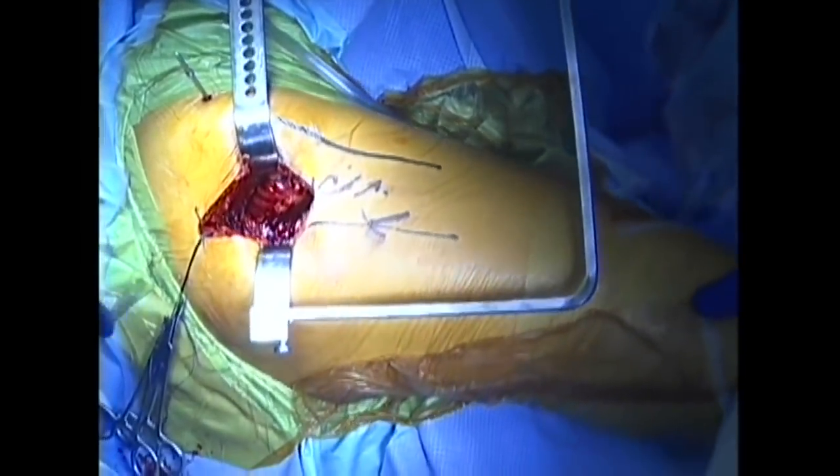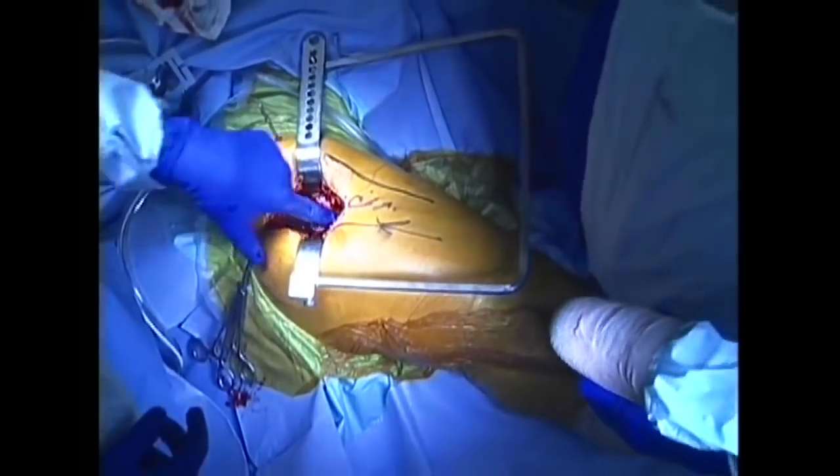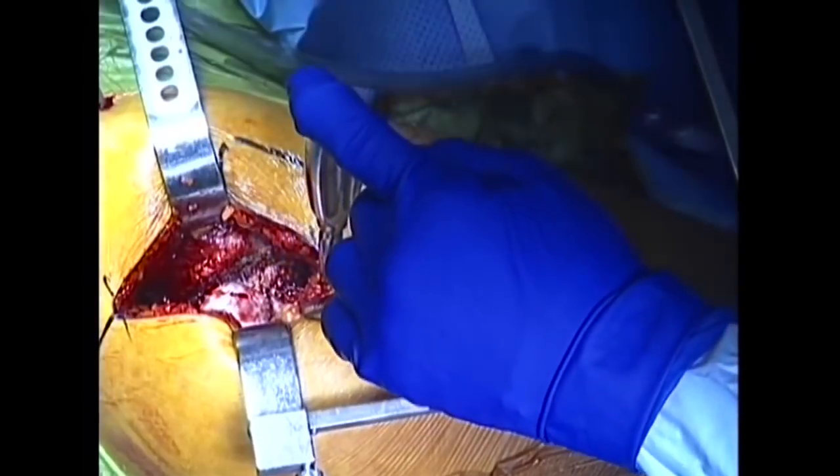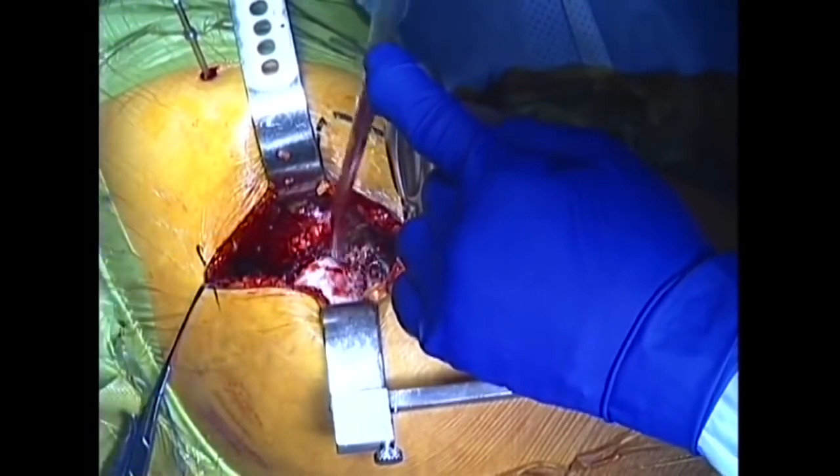The hip is ready to be dislocated. With flexion and rotation of the leg, the hip is dislocated, exposing the head of the femur, or thigh bone. The hip joint's arthritic ball and socket are now exposed.